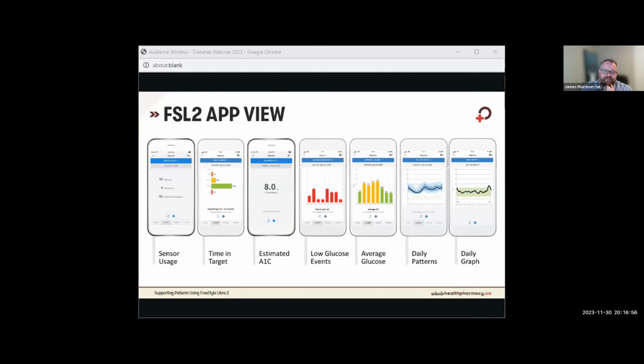And I found a lot of my patients thought they were doing better than they were. So I think there's often opportunities to help them understand their data even more so they can make better decisions in their self-management. Yeah, that's a great point.